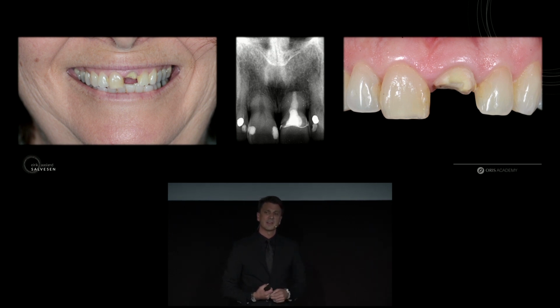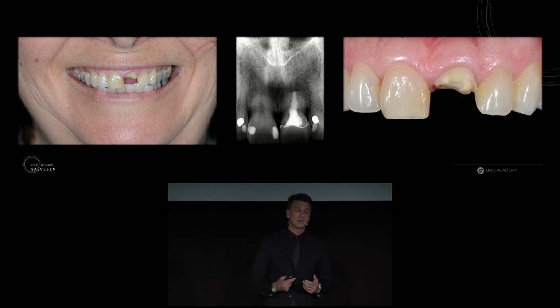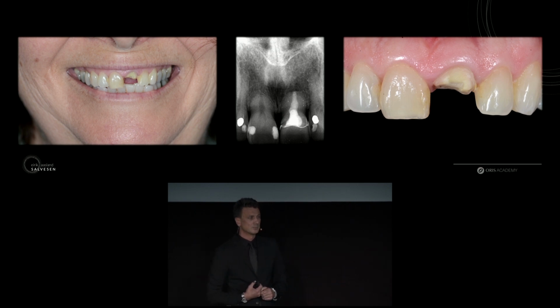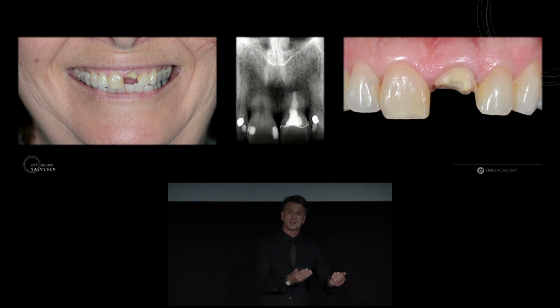And as you see on this case, you will have a high smile line. You see the case has an old trauma, so you see a reduced dimension of the roots. There was a prosthetic restoration done on this central 6 years ago. And when that fractured before summer, my question to my colleague was, do you want me to bond it back on? Because basically we can bond and see.